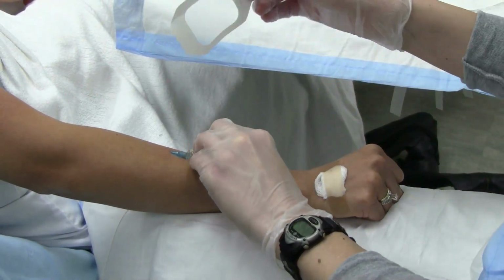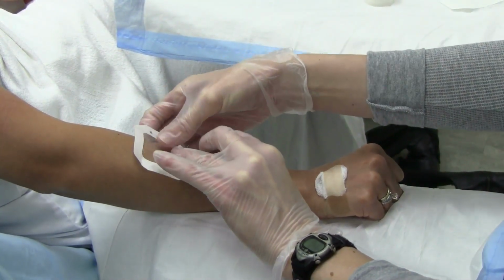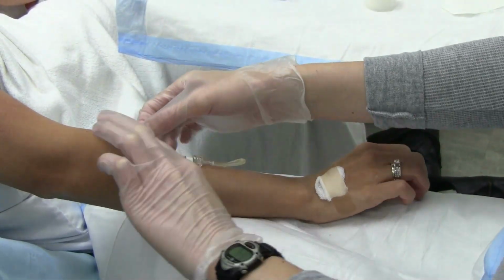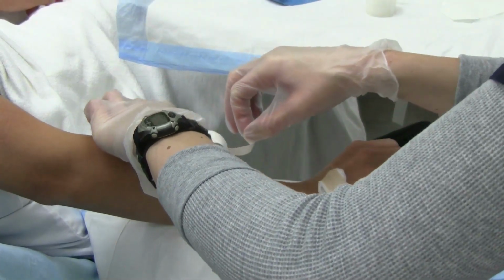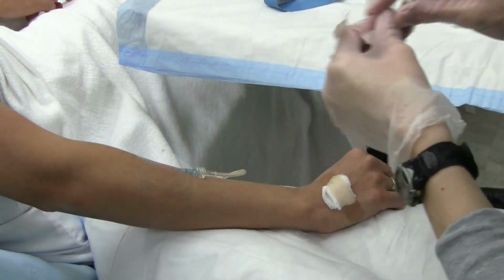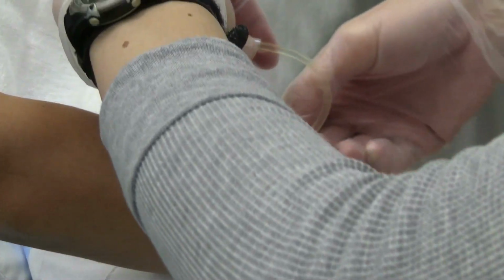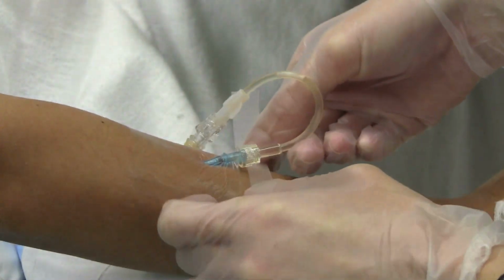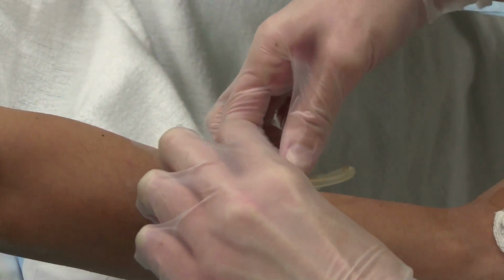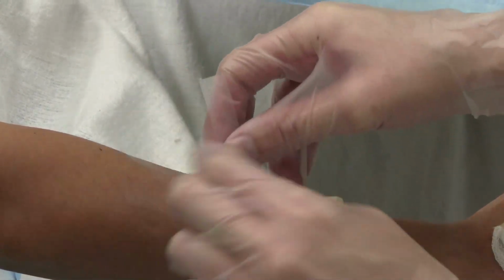If preceding steps fail to distend the vein, remove tourniquet and wrap the patient's extremity in a warm, moist towel for about 10 to 15 minutes. You may also minimize insertion pain as much as possible by using ice or an intradermal injection around the site that you're going to venipuncture. You may apply a padded arm board in order to splint the joint that has the venipuncture site within it.